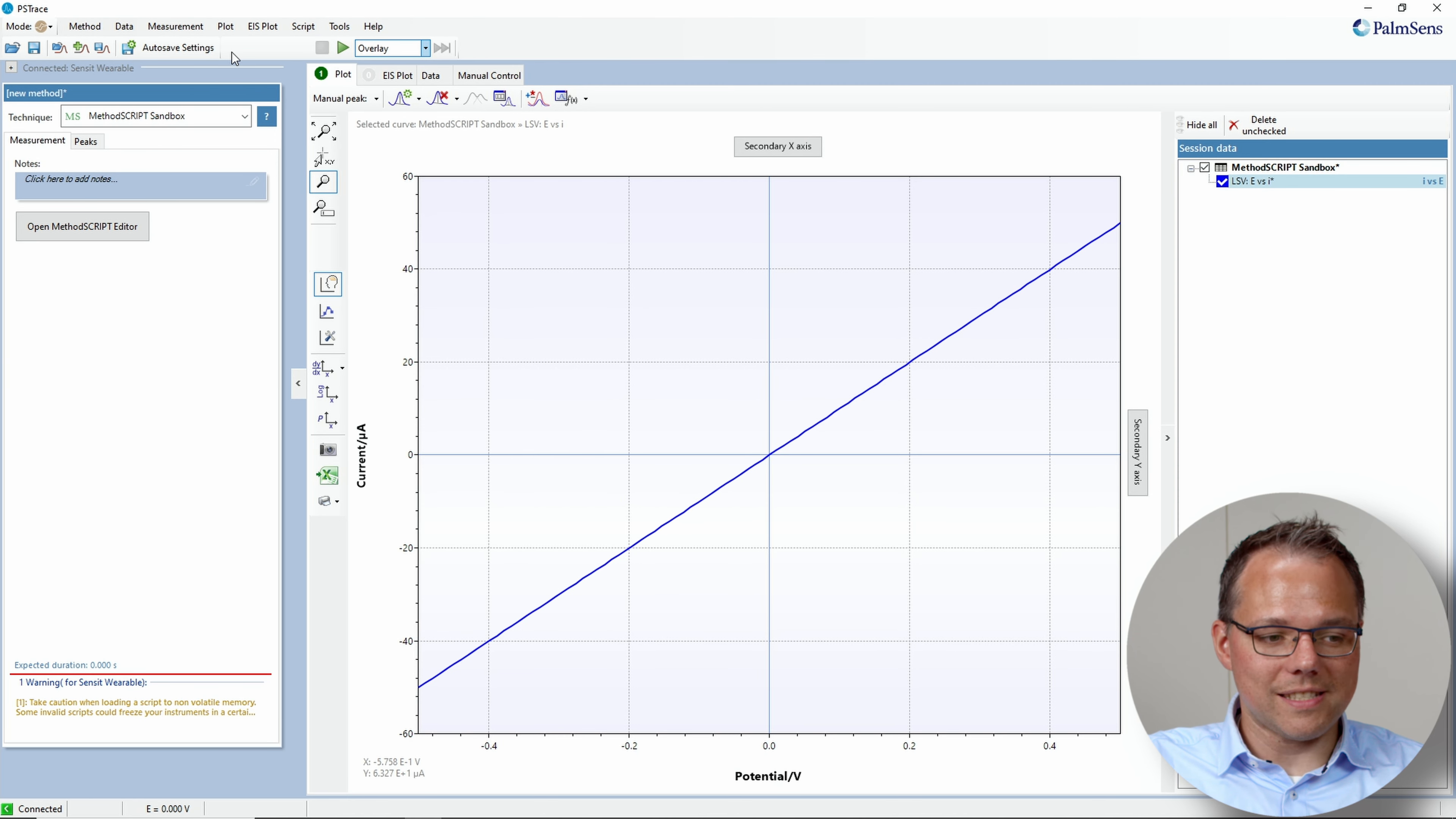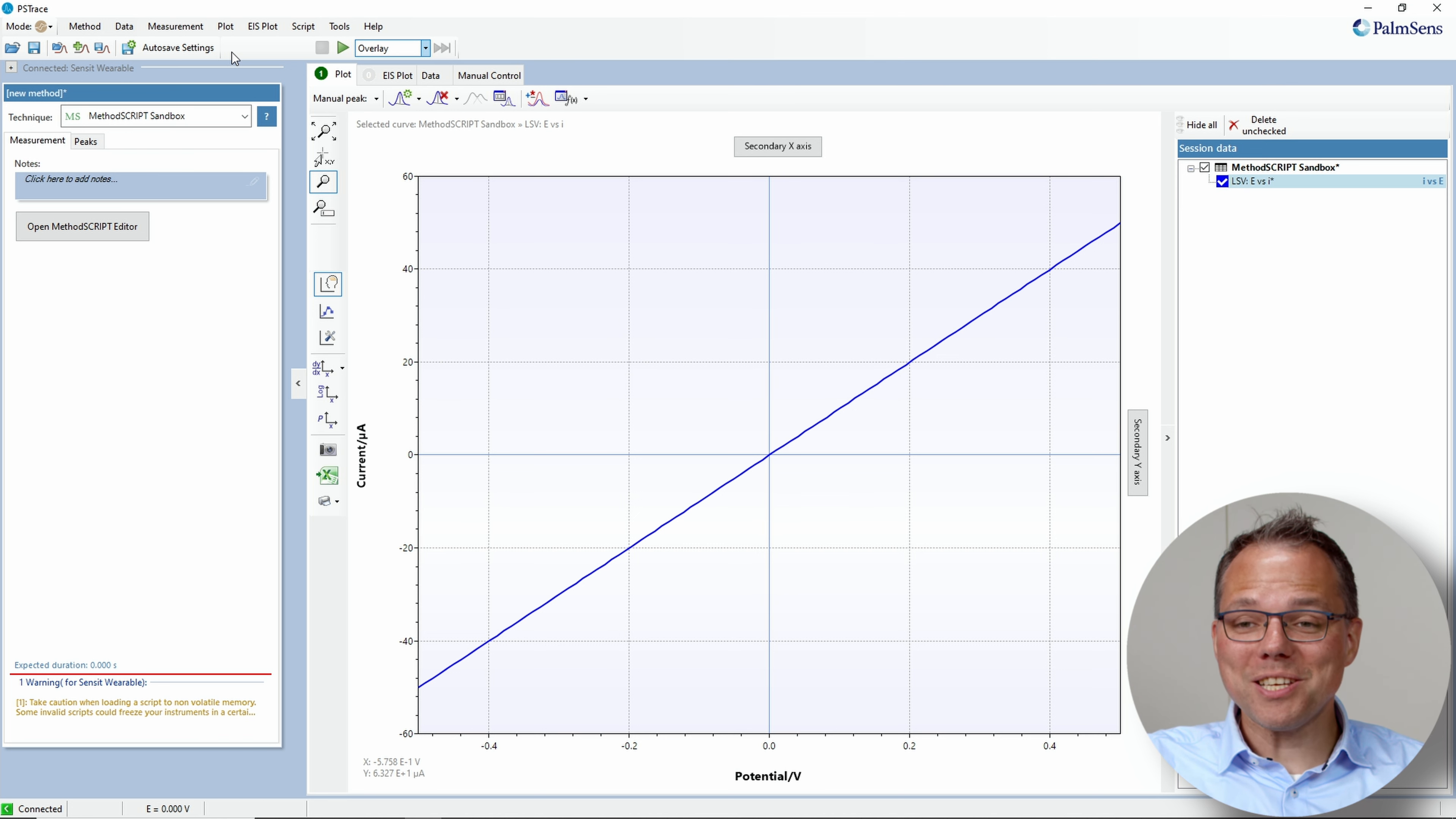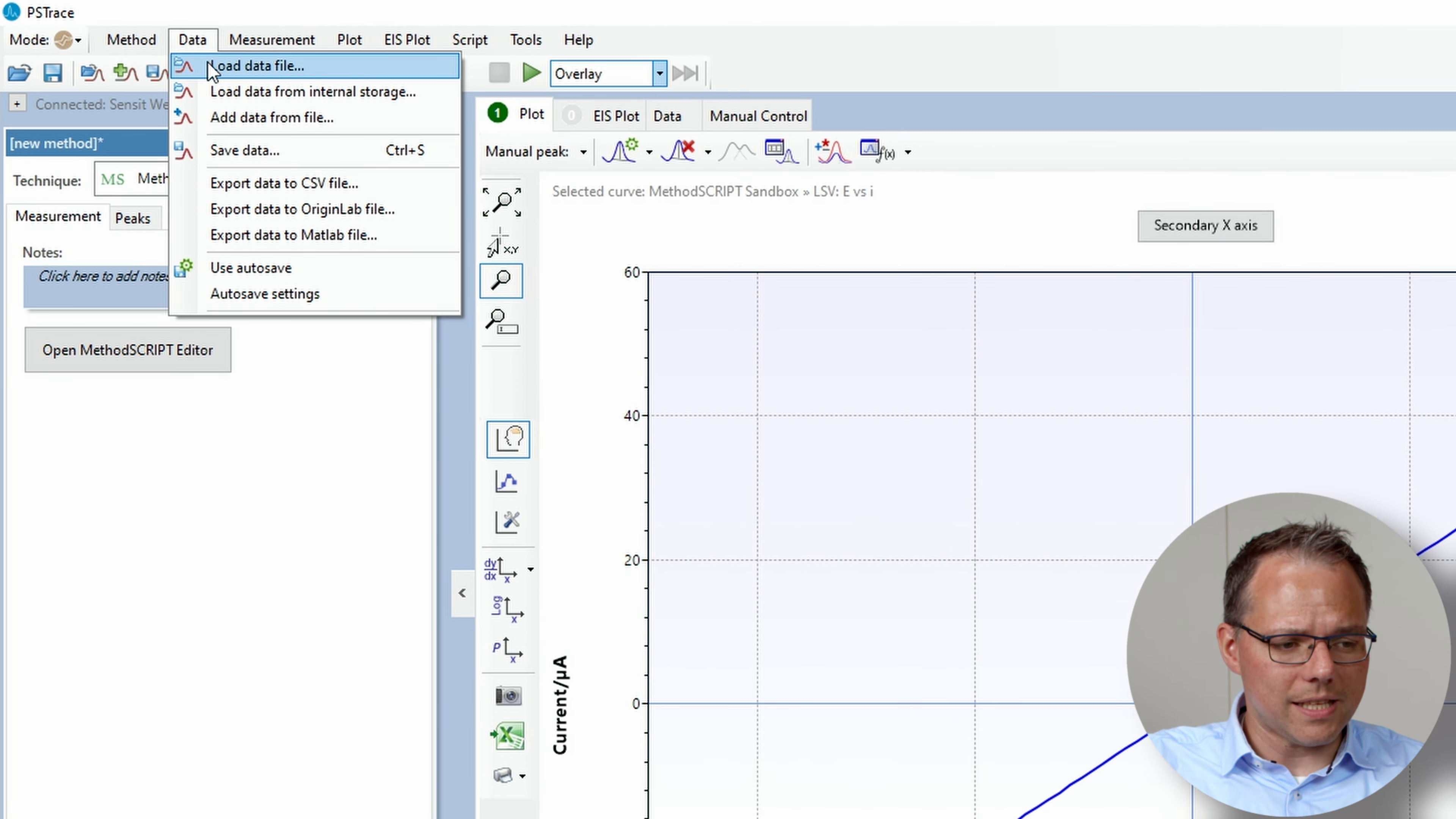Also I have switched on the function to use the internal storage and save it. So to show you in a minute that the measurement that we have done ended up in the internal storage let's first empty the internal storage.